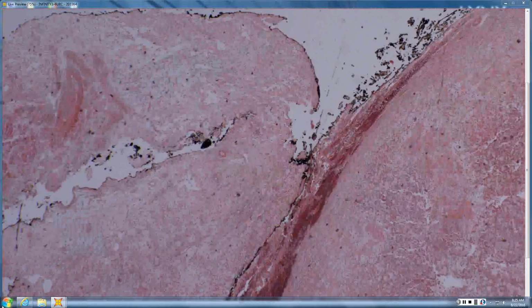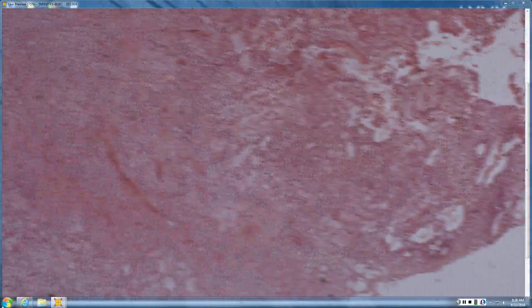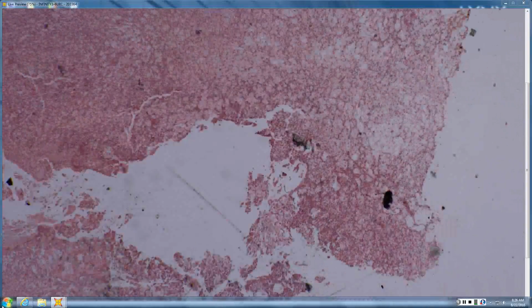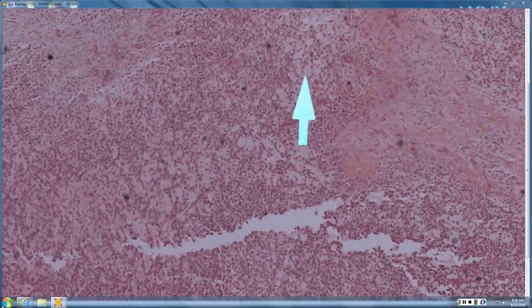So it looks like we almost have a kind of circumscribed nodule. Do you think it's circumscribed, or do you think the cut edge still has lots of tumor? Yeah, with that edge, just straight to the edge. I thought I saw the cuticle kind of on the edge. Looks a little bit like branching, a little like reticular. Kind of branching, alveolar, reticulated. I mean, you can make me think about a malignant mixed tumor, maybe. That's exactly what it is. It's a malignant mixed tumor.